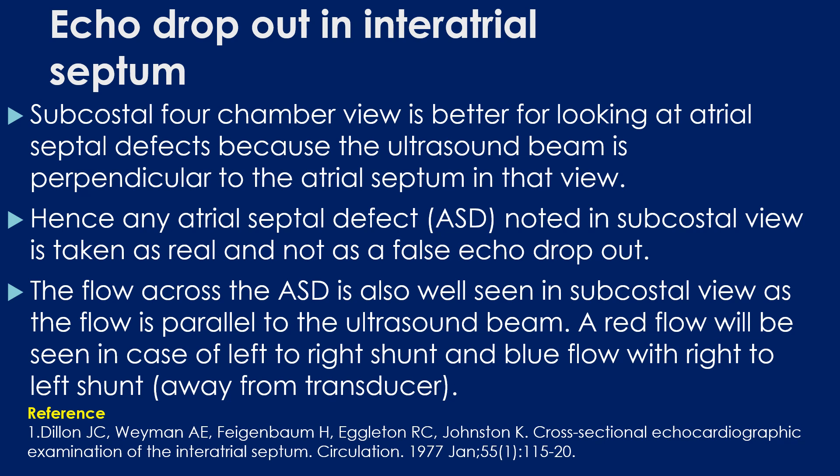A red flow will be seen in case of a left-to-right shunt, and a blue flow in case of a right-to-left shunt — that is, flow away from the transducer.